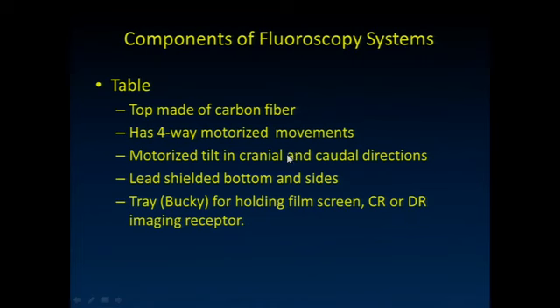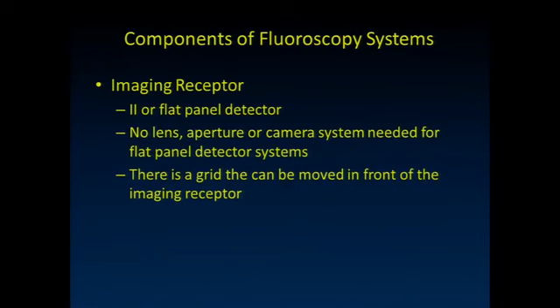And I really want to use GI fluoro because that's one of the times when you're in the room controlling the parameters that we talked about necessary to make the image. So components of the fluoro system: that image intensifier or that flat panel detector. So I'm going to ask the same question I asked yesterday. How many people still utilize some fluoro systems with an image intensifier instead of a flat panel detector? So there's a couple people. They are still out there. A few years from now, I think for me to talk about image intensifiers isn't going to make a whole lot of sense because they're being replaced fairly quickly.